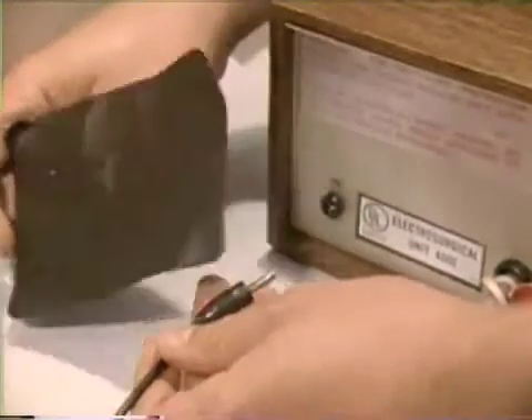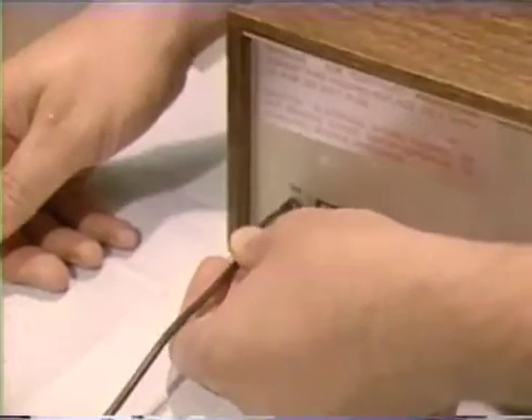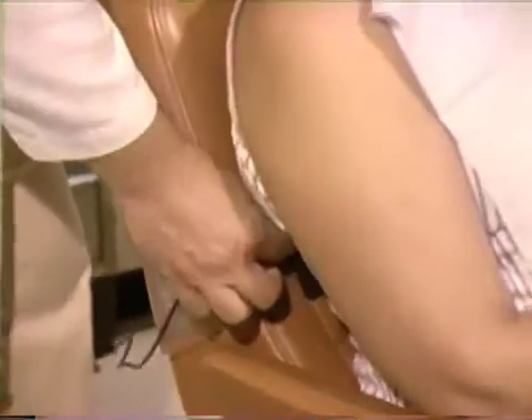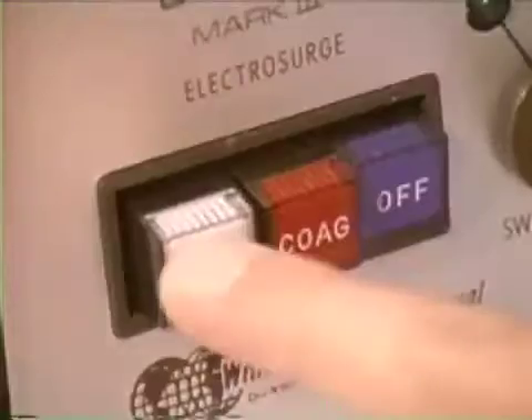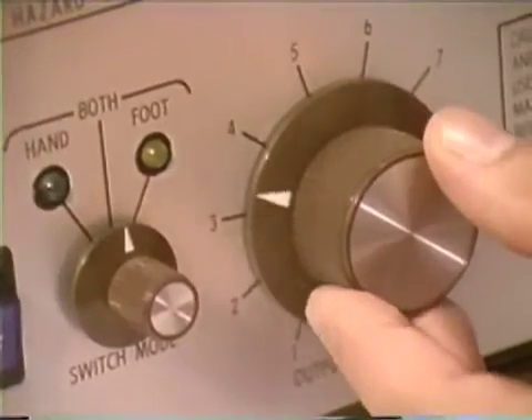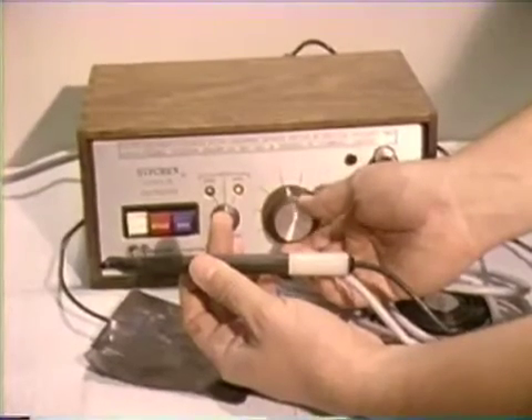A large metal ground plate, often termed the indifferent plate, is also plugged into the control unit and then placed between the patient and the upholstered backrest of the dental chair. The control unit is activated by the cut switch, and the current output intensity to the cutting tip is adjusted with the rheostat on the front panel of the control unit.